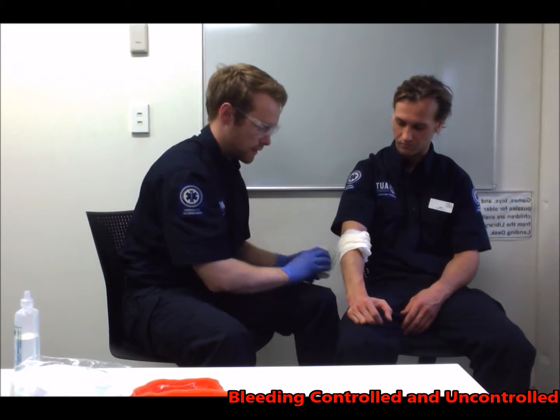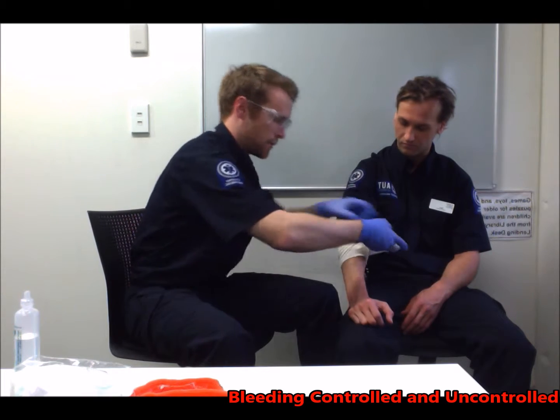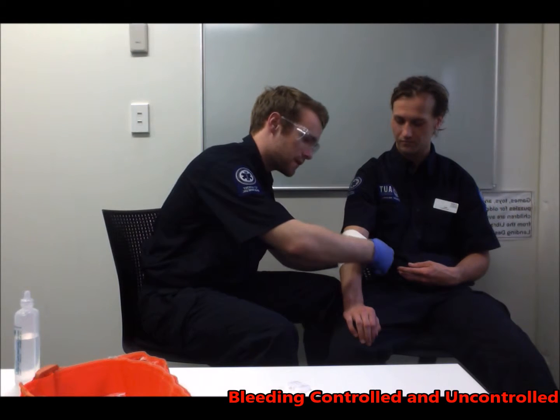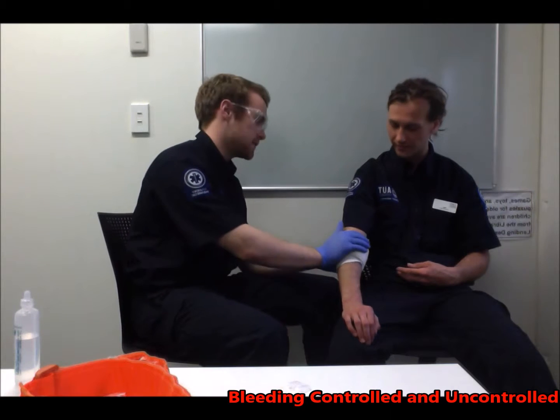Just twisting again. It's nice and tight, putting a lot of pressure on the wound, a lot of direct pressure. Yeah, and just wrapping this around, and finally just tuck it in on itself, just to hold it there secure. So is that nice and tight there, Sam? Yeah, that's good, thank you.